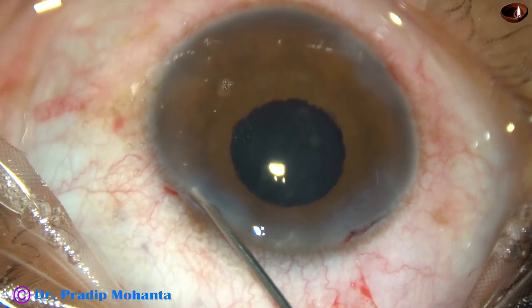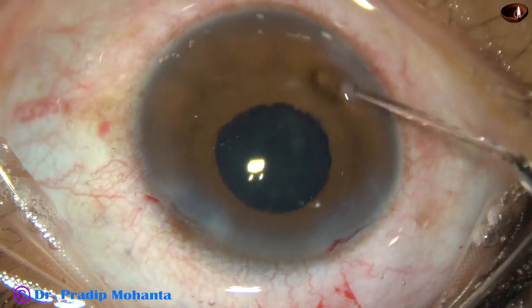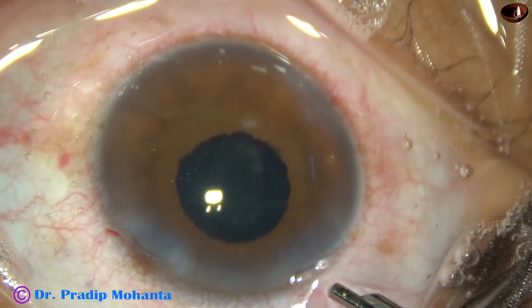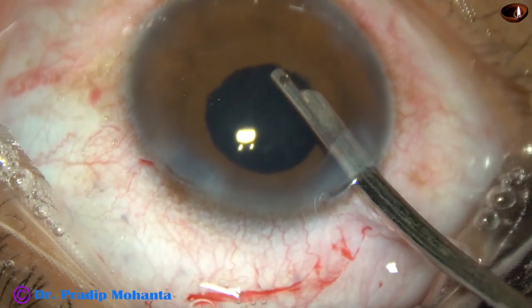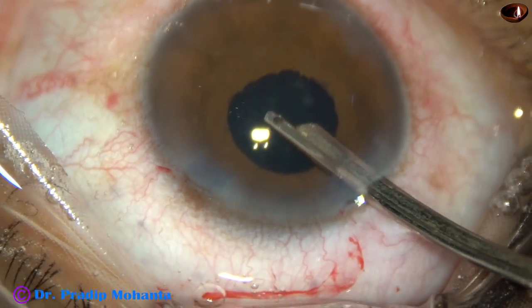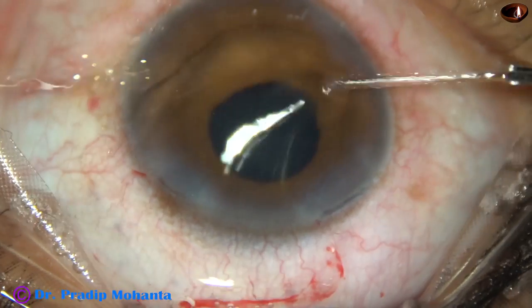So the surgery is almost over by this time. Visco has been removed, and the side ports have been closed by corneal stromal hydration. Now this is the final lavage of the anterior chamber. There should not be any viscoelastic substance remaining in the anterior chamber — then form the anterior chamber nicely.